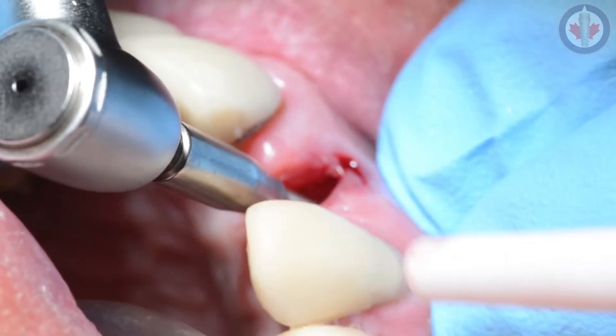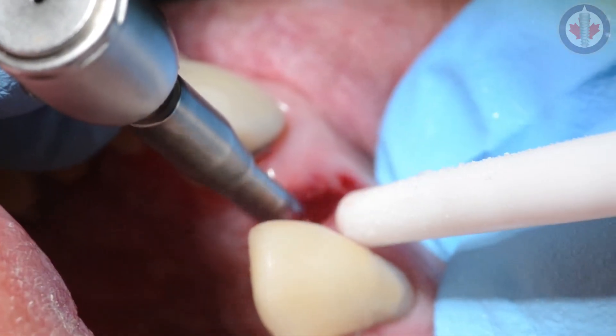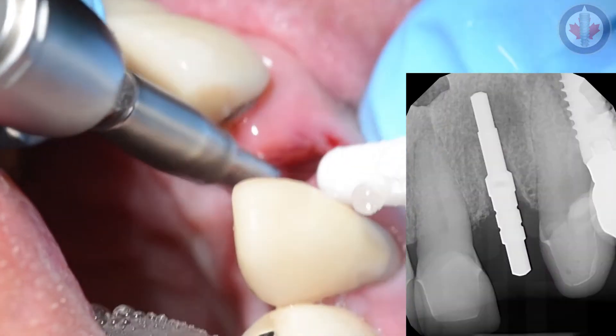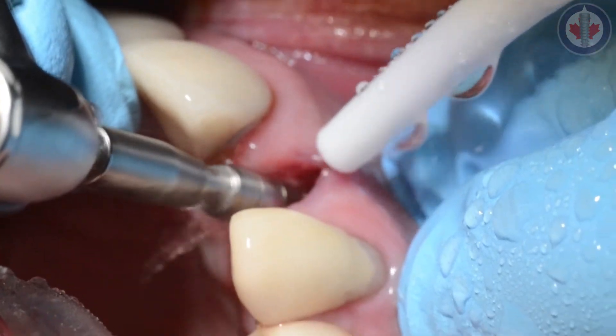Using our implant precision drill, we're going to start in a position at the labial and move it more towards the palatal. The purpose of this is to engage that dense palatal bone for primary stability. We take a pin and take a radiograph to ensure we're going in the proper direction. The pin, in this occlusal view, will also show that we have a screw-retained position for this implant.